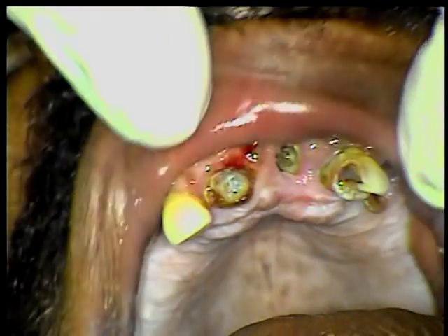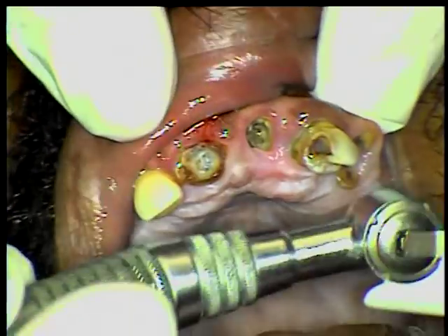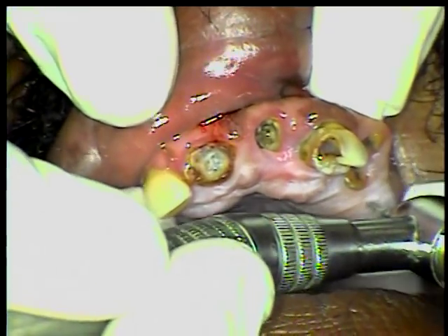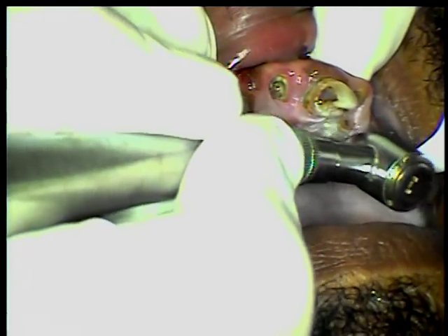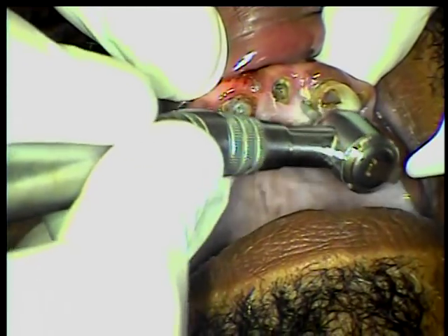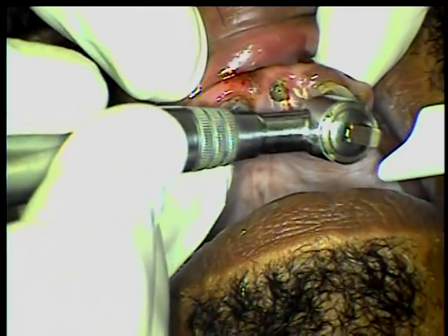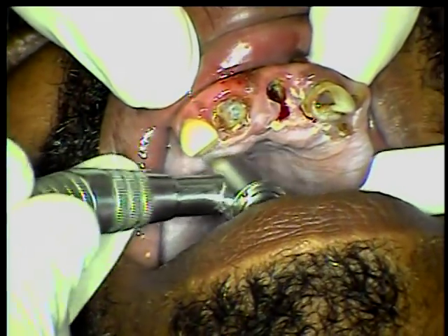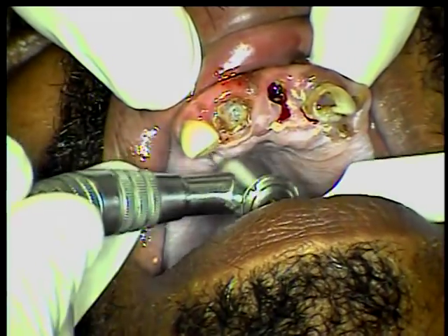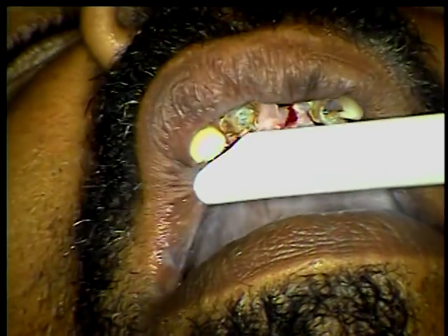First, what we're going to do is open, use my little diamond, and open. Push and go down. Push and go down. This one here is a little difficult — push and go down. All we're doing is going down the root so the beak of the instrument has a better purchase point.